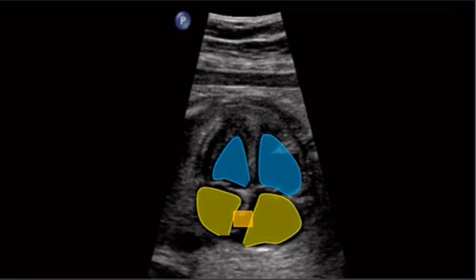Well, maybe. But remember, this is a kid in utero, so they're going to have a patent foramen ovale, right? And it's really hard to tell the difference between a patent foramen ovale and a small secundum ASD. So if they do show you that, I don't think they can list both a small secundum ASD, which remember is the common one, and a PFO, and have you distinguish between them. You can't practically distinguish between that very easily, or at least I can't. So you would hedge on that.